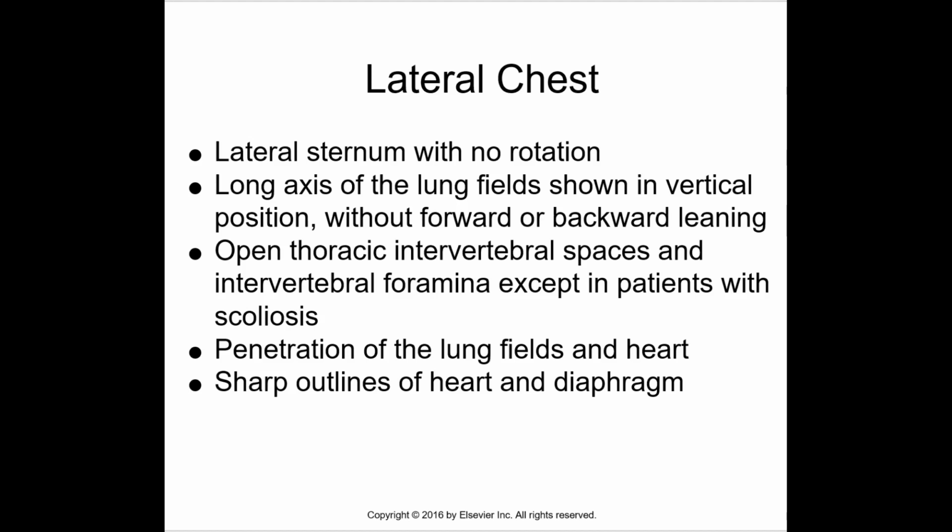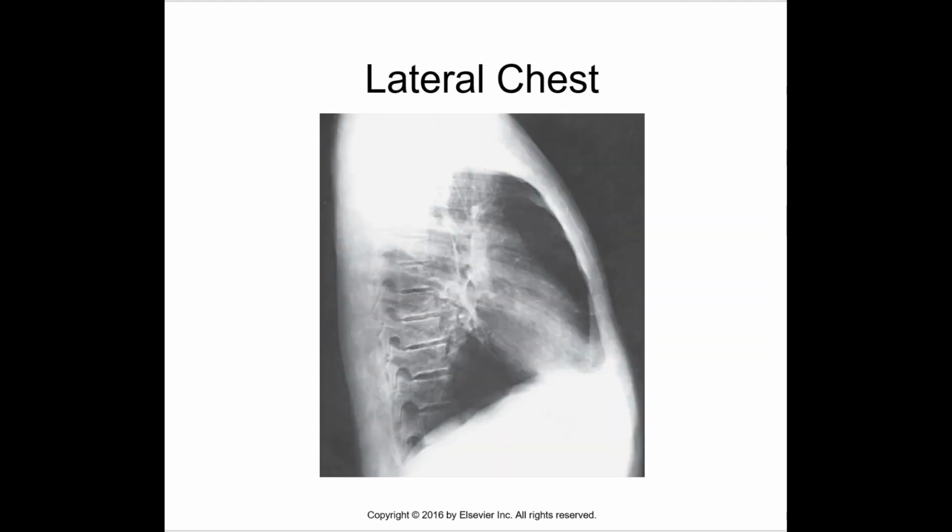Penetration of the lung field and heart, sharp outlines of the heart and diaphragm. So here's an example of a lateral chest.